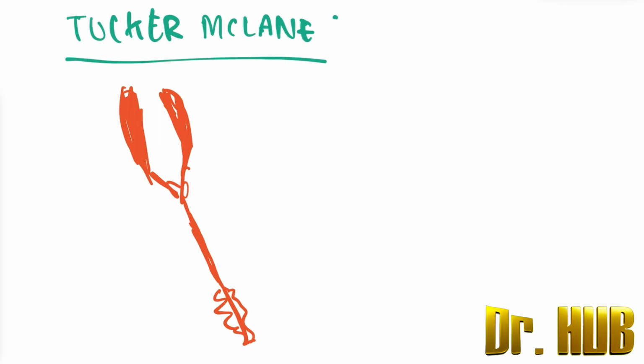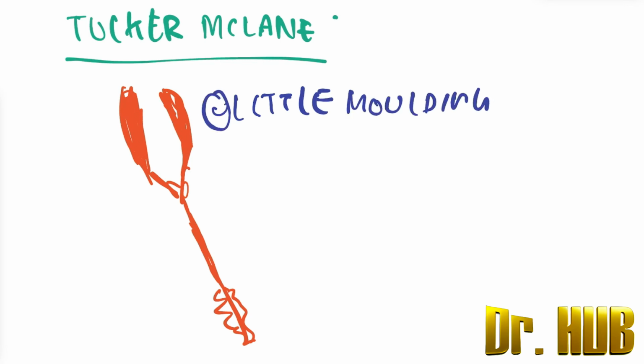It is suitable for the fetal head with little molding, and it is used in rotational delivery.